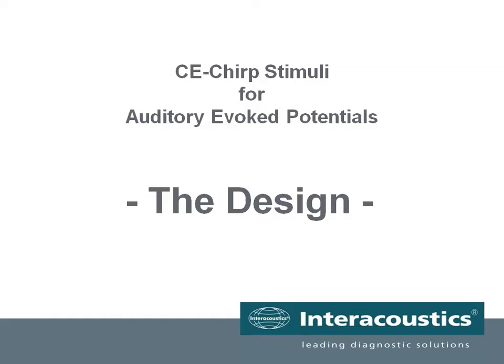This presentation is an introduction to the CE-Chirp family of acoustic stimuli that are developed to increase response amplitude and in this way reduce test time when doing threshold assessments with ABR or ASSR.